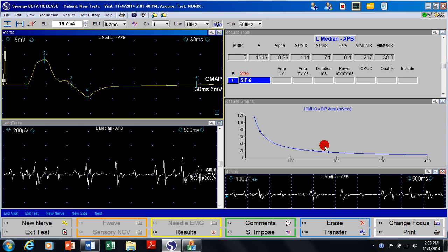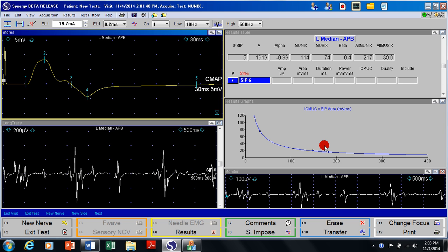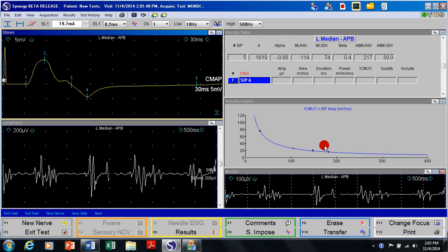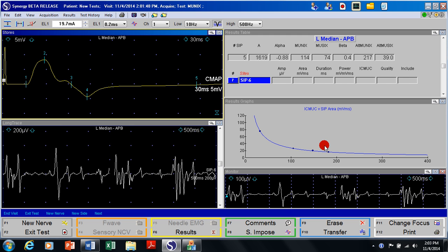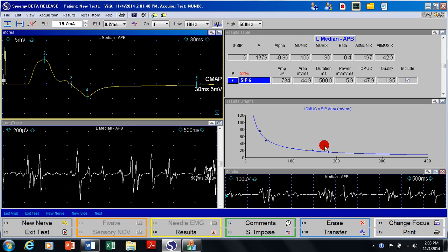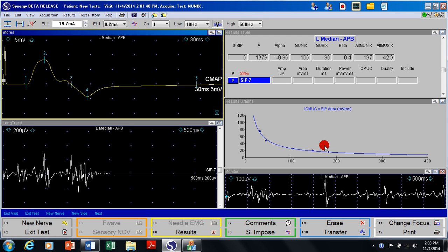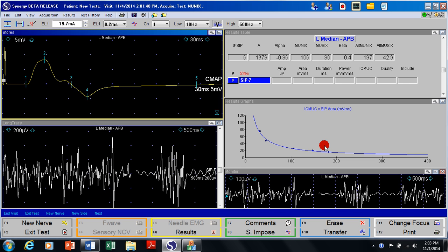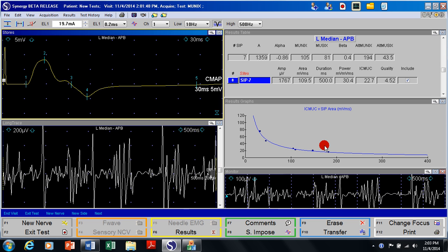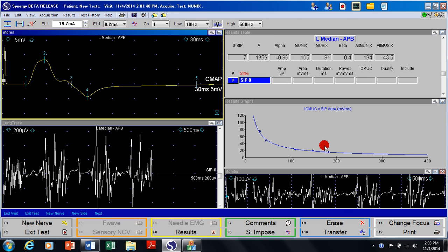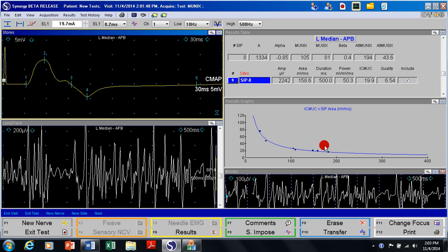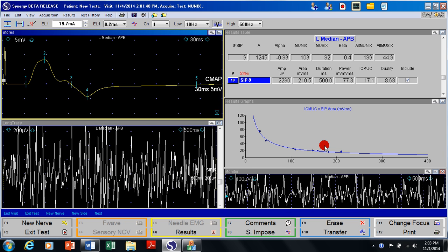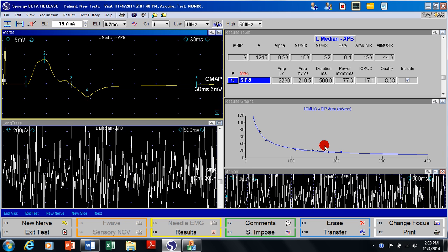I'm going to do now another trial. This is going to be a slight effort, starting over here, then a little bit more effort, more effort, more effort and maximum.